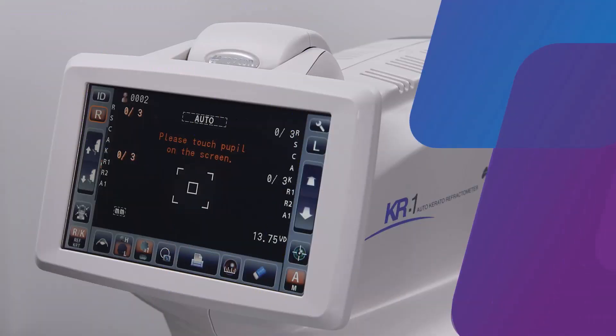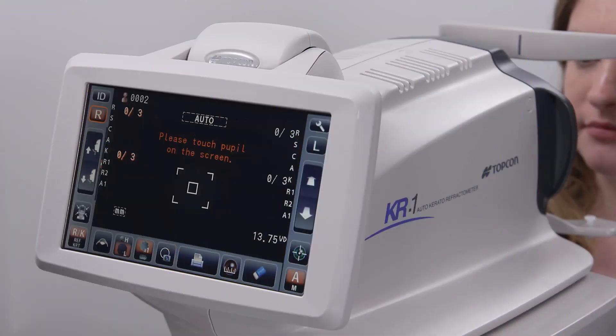In this video, we will be discussing how to acquire basic measurements on the KR1. To begin acquiring measurements, first clear any previously acquired data by selecting the eraser icon.